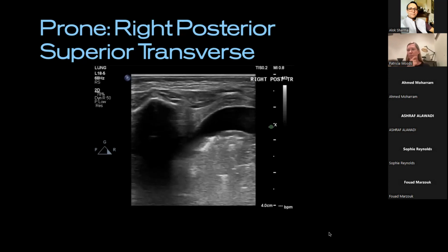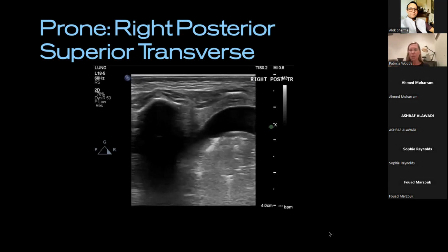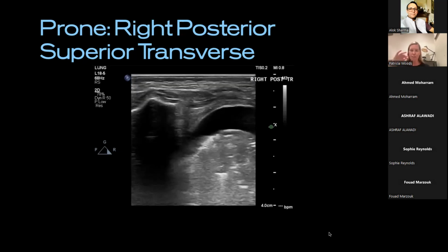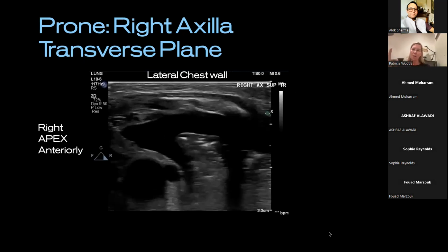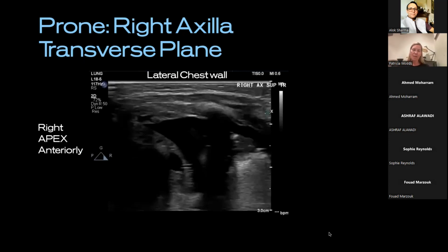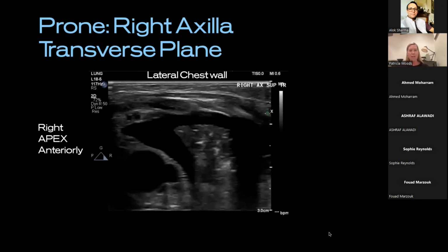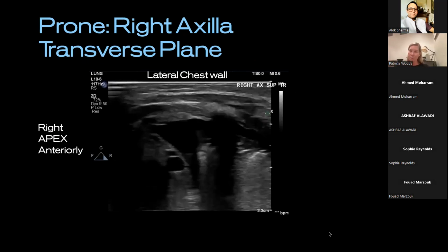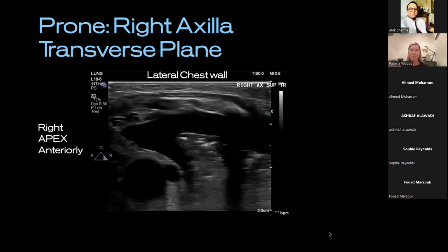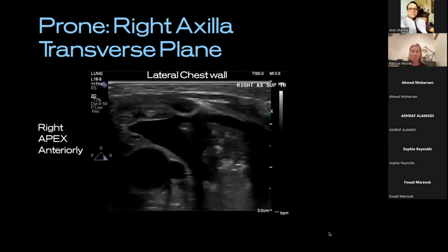This was significant for a baby nursed supine, that you can only imagine as the fluid, as I take you through, is just surrounding and coming up anteriorly. So all I've done here is slip the probe slightly more laterally. So it's a transverse plane in the axilla this time, not pointing down to the bed. And again, you're observing the whole picture this time, building a 3D example of this lung floating around up in this baby's sort of axilla.